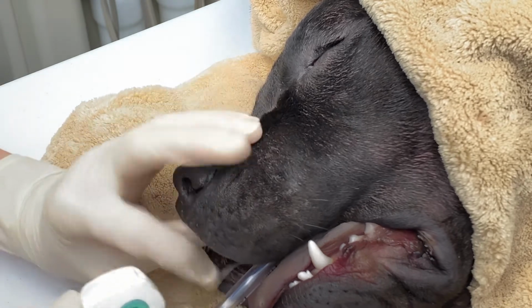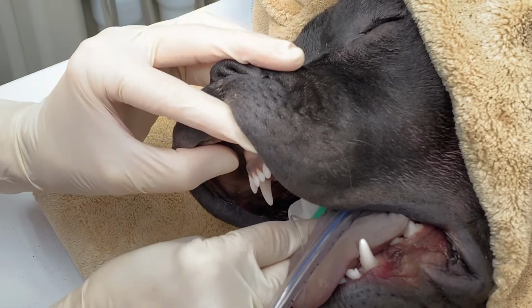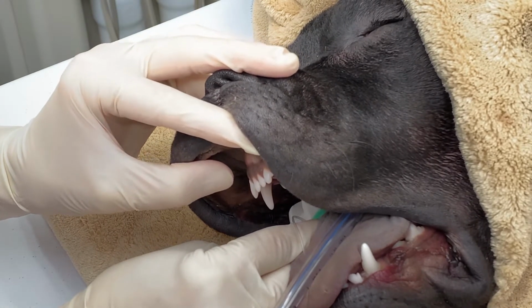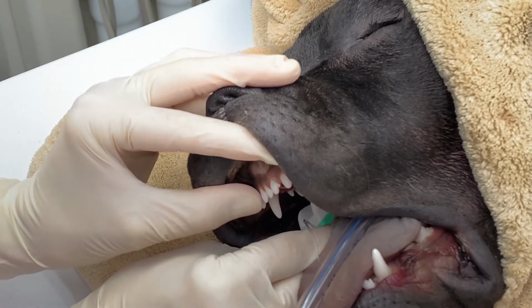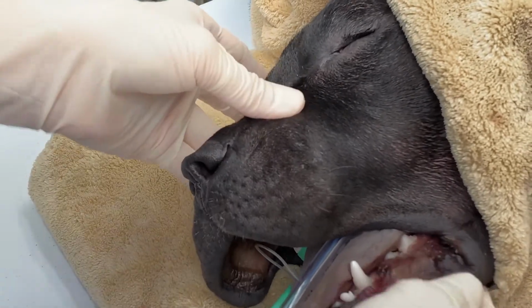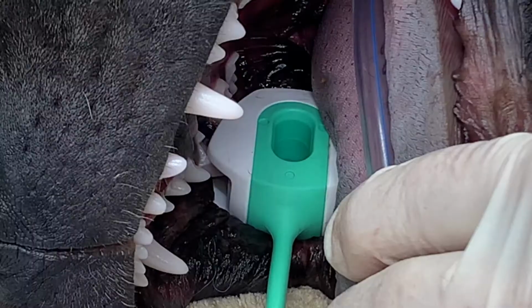So what you'll do is come underneath here and open up the mouth just a little bit, and place the tips of the crowns of that upper fourth premolar on the top part of the guard, and on the bottom part of the guard where the ridges are, you're going to put the tip of the first molar. And now your patient's mouth is nice and propped open, your sensor will be protected, and you can begin acquiring your images.